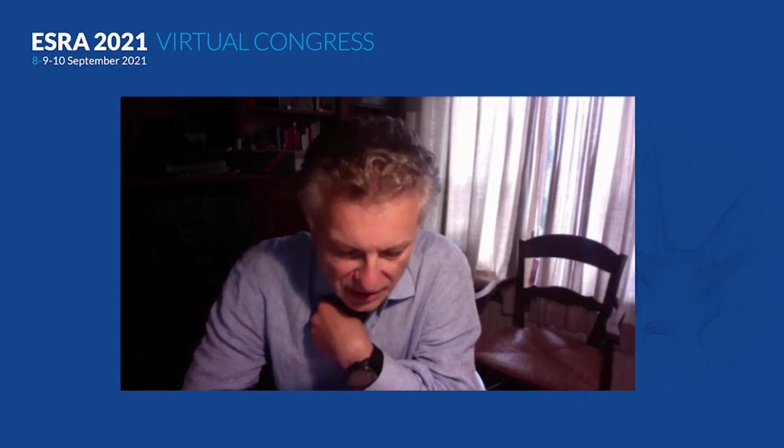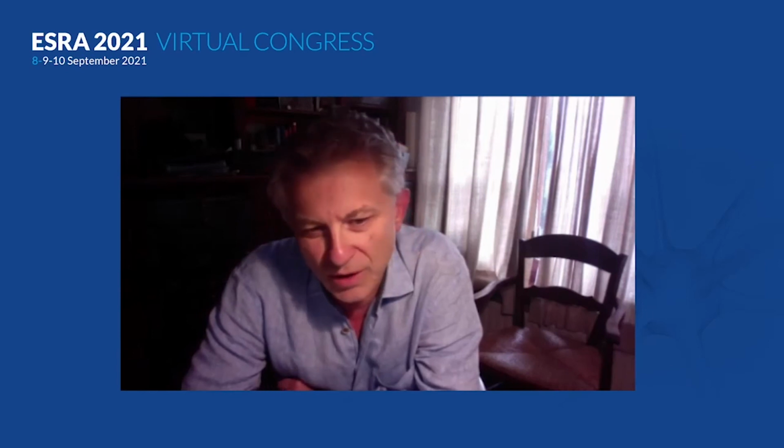It is important to know that we cannot avoid peripheral nerve injury. This lecture was, and I would like to emphasize, to show you how to minimize the risk. And the risk can be minimized when you use that algorithm, of course, but also with a gentle and careful manipulation of the needle. That is mandatory. If you are, let's say, brutal, then it will be a higher risk than if you do it gently with a good visibility of the nerve on ultrasound. I think the risk is even less.